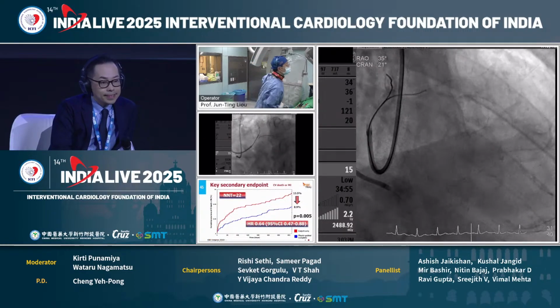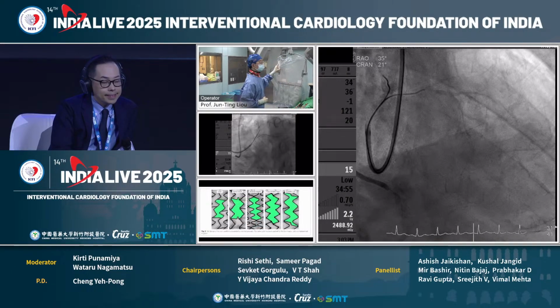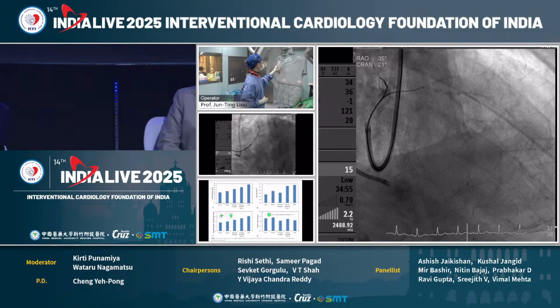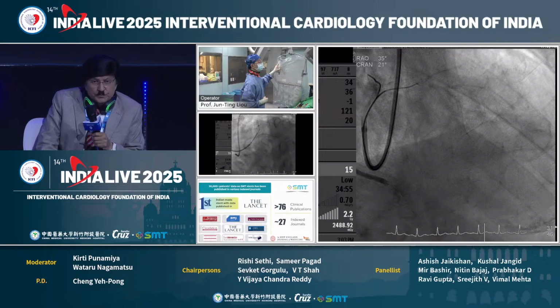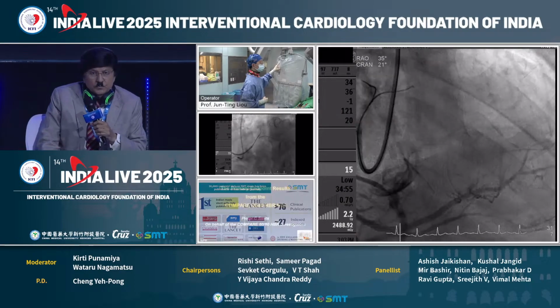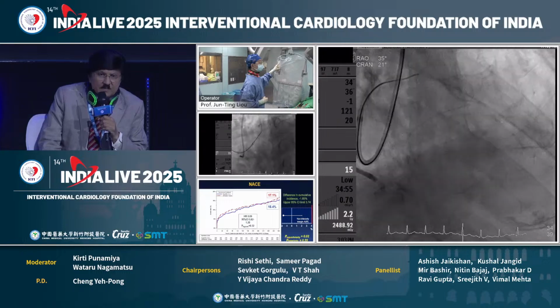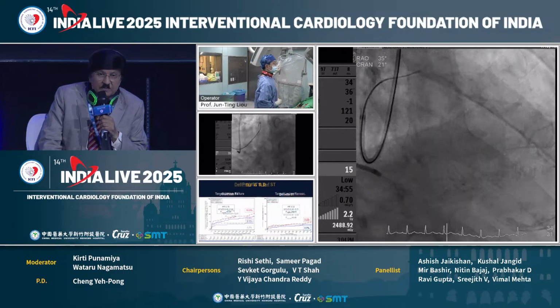We almost reached the proximal CTO, but I don't know, can you see the angulation between the CTO lesion and the entry into the LAD? Maybe it's difficult to see the lesion. We can see that your wire has slightly buckled at that place. Yes, okay.